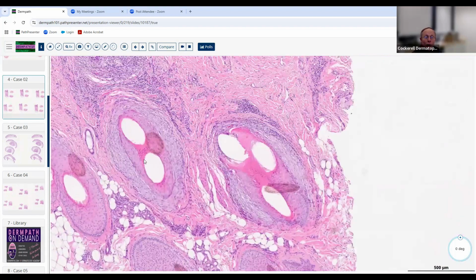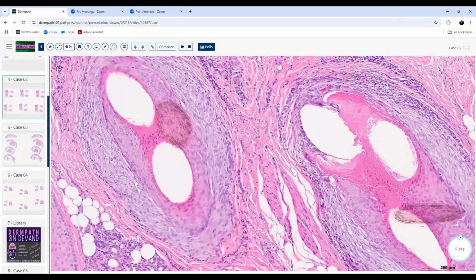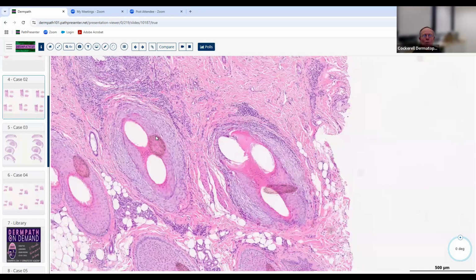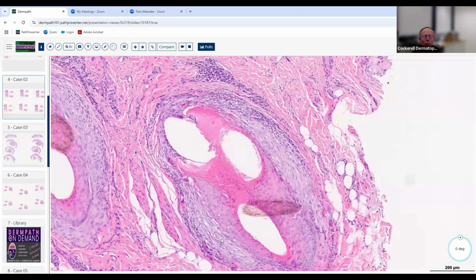You see this perifollicular fibrosis here? This is earlier stage, and this is probably tangentially sectioned. So this is really higher up somewhat. So it's probably kind of in the mid-reticular dermis. This is probably about the level of the infundibulum here. And you get this perifollicular fibrosis here.